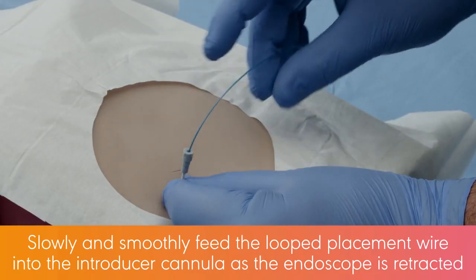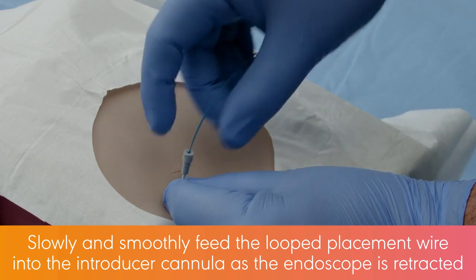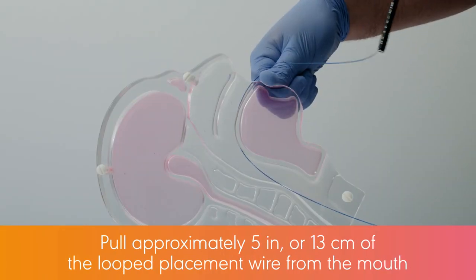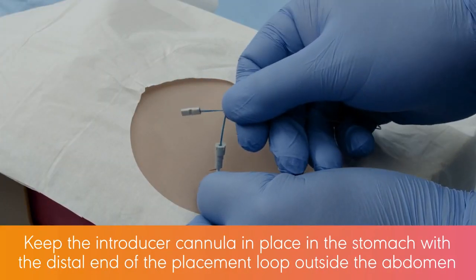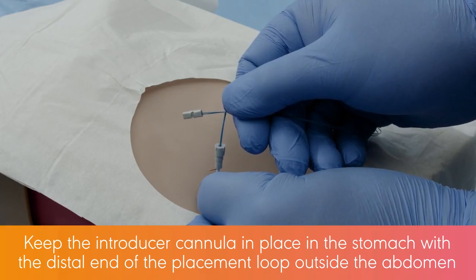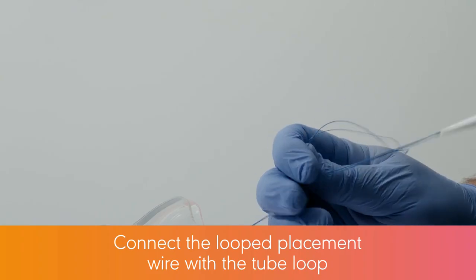Slowly and smoothly feed the looped placement wire into the introducer cannula as the endoscope is retracted. Pull approximately 5 inches or 13 centimeters of the looped placement wire from the mouth. Keep the introducer cannula in place in the stomach with the distal end of the placement loop outside the abdomen. Connect the looped placement wire with the tube loop.